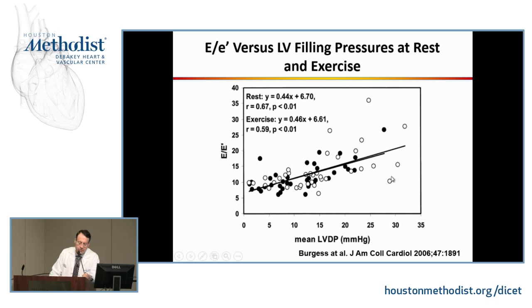There are very few studies in terms of exercise echo Doppler parameters against exercise cath. There was a decent correlation in these patients, from the investigators who measured mean LV diastolic pressures.